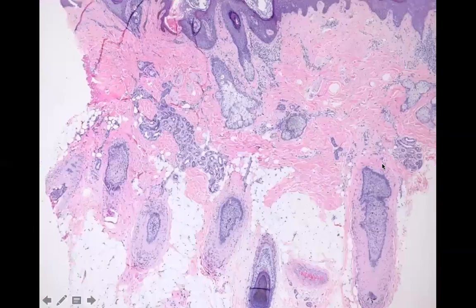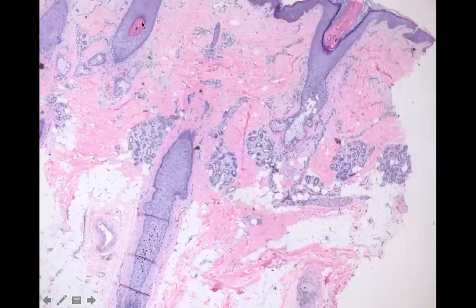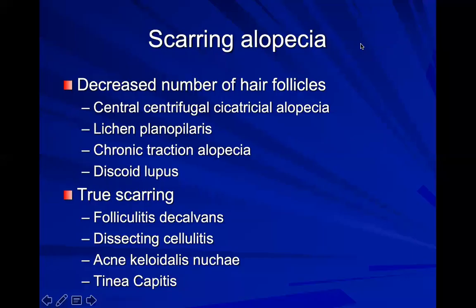This is trichotillomania. Here is a vertical section. You see how all of your hairs are in this kind of telogen phase. You've got a lot of pigment in them. You can see that pigment in alopecia areata too. But when you go up to the epidermis, that's when you're going to start seeing your trichomalacia. Okay, there's your pigment casts.